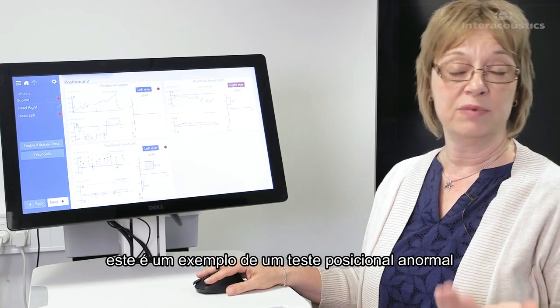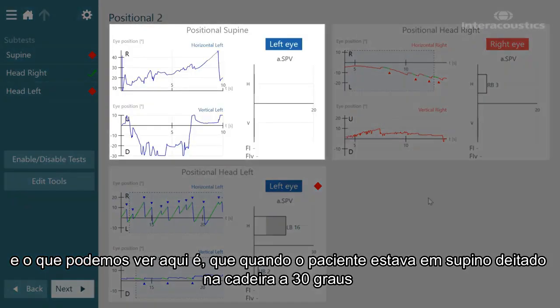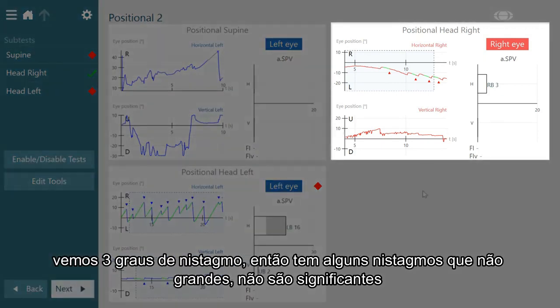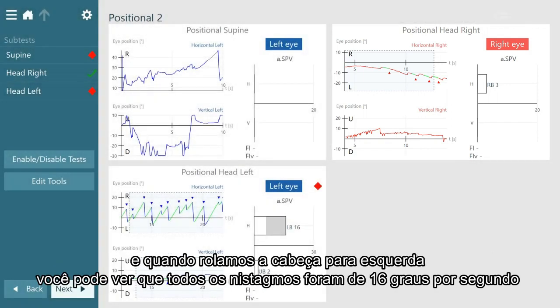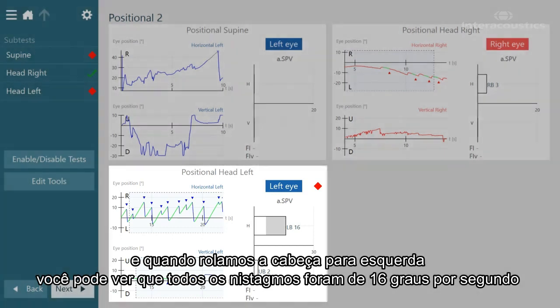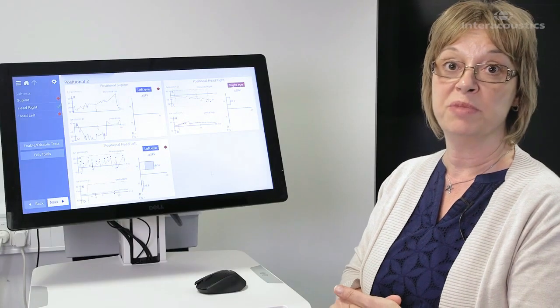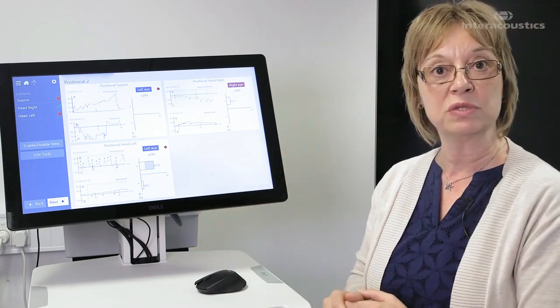This is an example of an abnormal positional test. When the patient was supine — lying in the chair at that 30-degree angle — there wasn't any noticeable nystagmus. When the head was rolled to the right, we see three degrees of nystagmus — there's some, but it's not significant. When the head was rolled to the left, the nystagmus went all the way up to 16 degrees per second. This is a definitive finding for left lateral canal BPPV, because the nystagmus is present in both directions but is stronger when the head is rolled to the left.